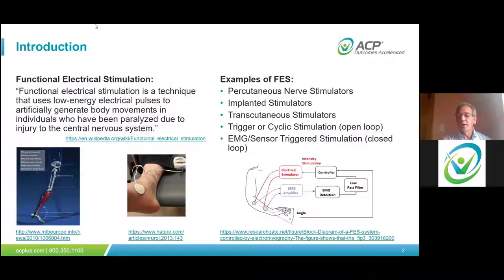There are 2 different variations within this concept of using FES. One we would refer to as an open loop system. And the open loop system has a trigger device that applies the stimulus by a therapist, right? And the therapist is going to say on or off, depending upon their timing that they're seeking. Very good for training. You can then incorporate the stimulation as part of the training process into the activity as a skilled technique. But it's not very adaptable beyond the therapy context, of course.